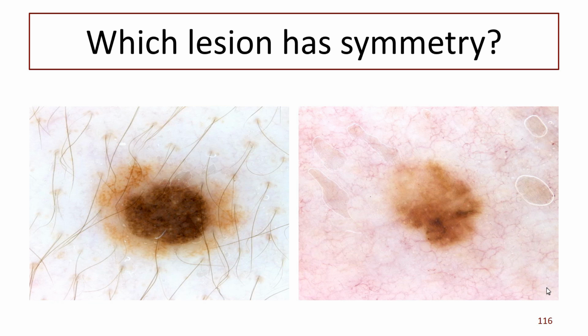Because these bits all look the same. If you just had one bit that looked a bit odd, I think that would be worth watching. But really, it looks as if it should be a complete circle around it. It takes practice, but again, you're going to examine your whole patient.